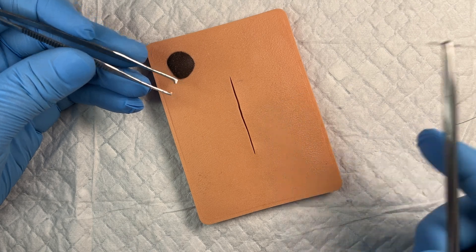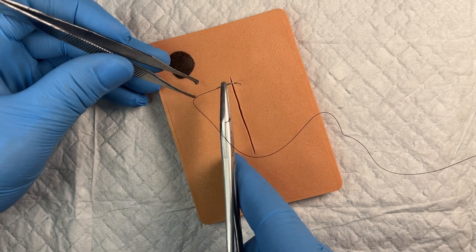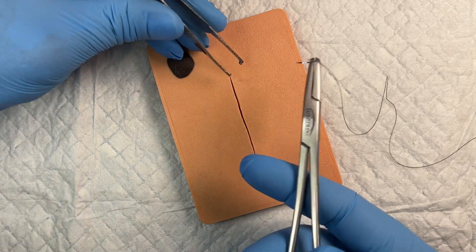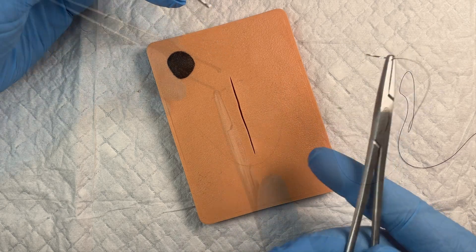In this quick demonstration video I want to show you how to do a figure of eight or cruciate suture. If you want a longer, more detailed video instruction, I have another video that will go through this in more depth.